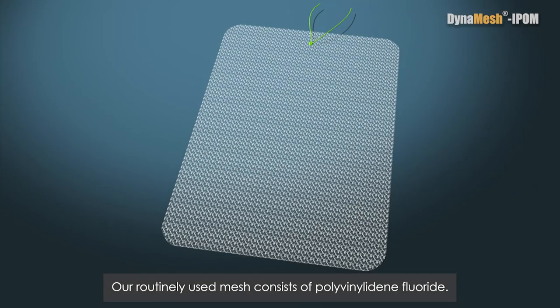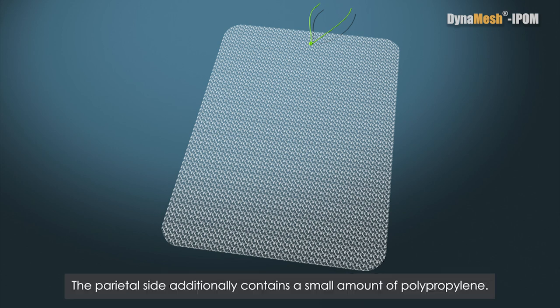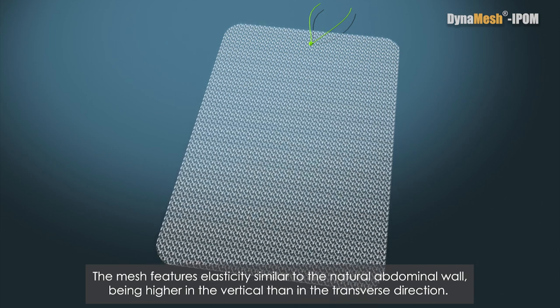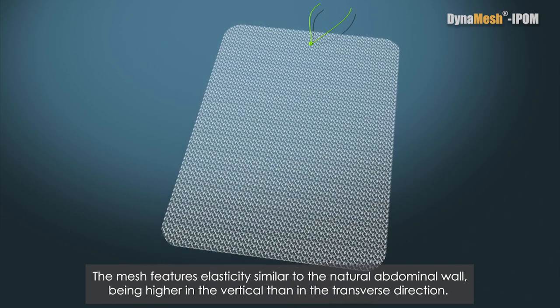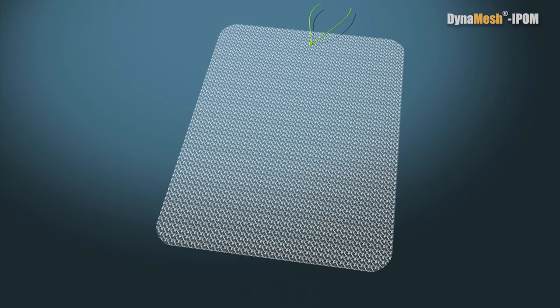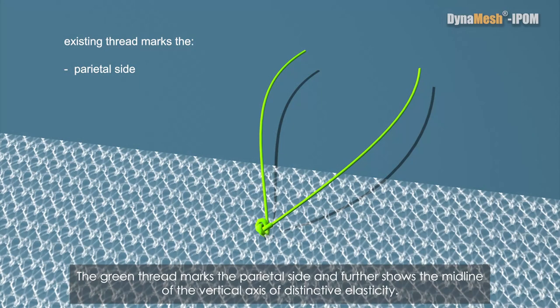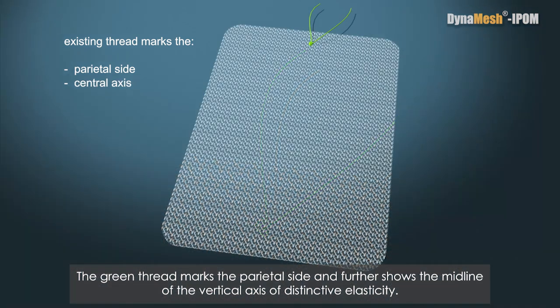Our routinely used mesh consists of polyvinylidene fluoride. The parietal side additionally contains a small amount of polypropylene. The mesh features elasticity similar to the natural abdominal wall, being higher in the vertical than in the transverse direction. The green thread marks the parietal side and further shows the midline of the vertical axis of distinctive elasticity.